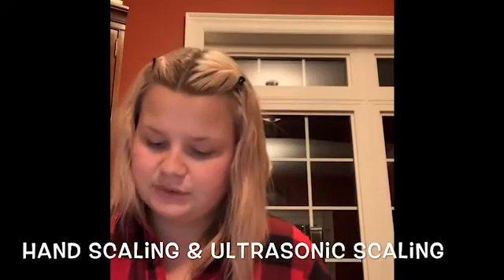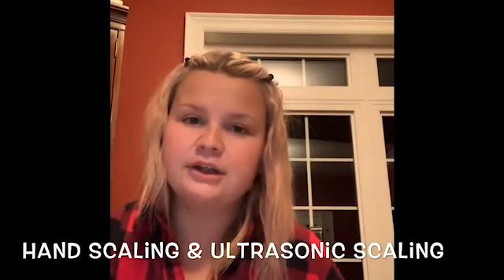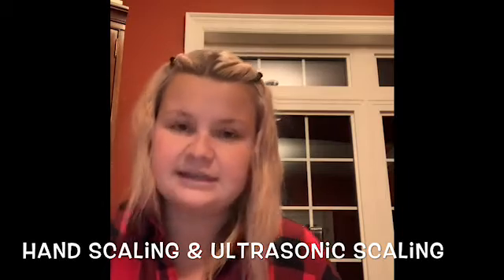Ultrasonic and manual scaling techniques produce equally good results in calculus and dental plaque removal. The ultrasonic scaler provides rapid calculus removal and reduces hand fatigue for the operator. Newer styles and slimmer instrument tips have been designed to provide easier access to subgingival pockets.